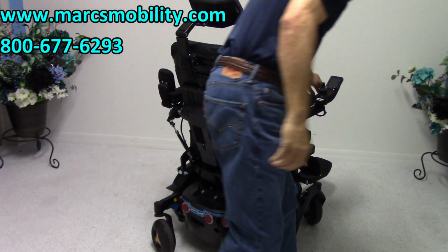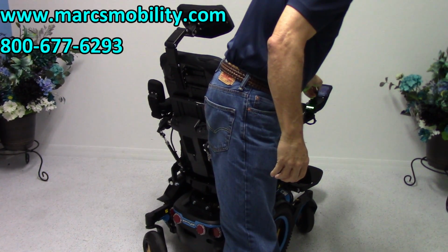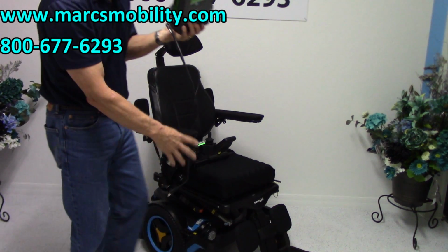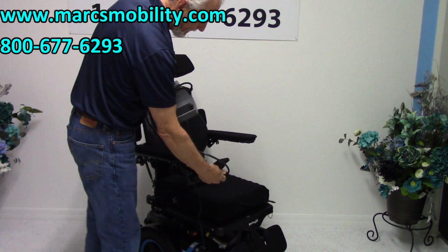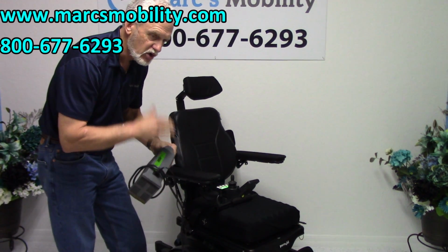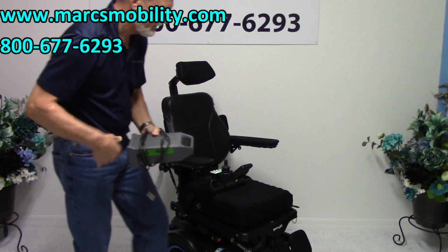So let's recap. Well, before we recap, let's talk about the charging method, how you charge this chair. You'll get your Permobil charger with your chair, and you plug it below the joystick, and as soon as the light goes all the way to the top on your Permobil charger, when it reaches fully charged, the charger will stop charging, so you don't have to worry about overcharging your chair.